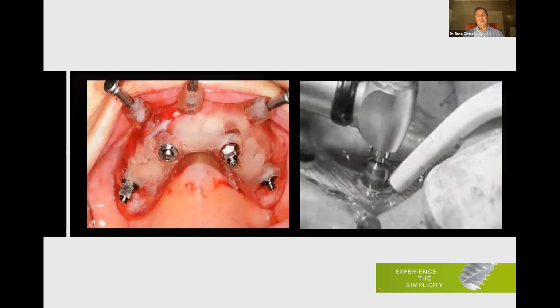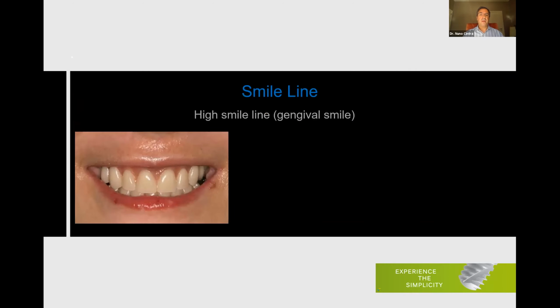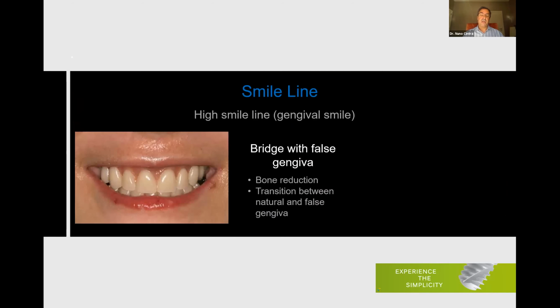And in this kind of situation, it's the only time that I can consider flapless surgery, because we are not touching anything. We are not reducing the gum, and we are not reducing bone. So that's the time to use a flapless approach. Or we can go for a bridge with false gingiva.